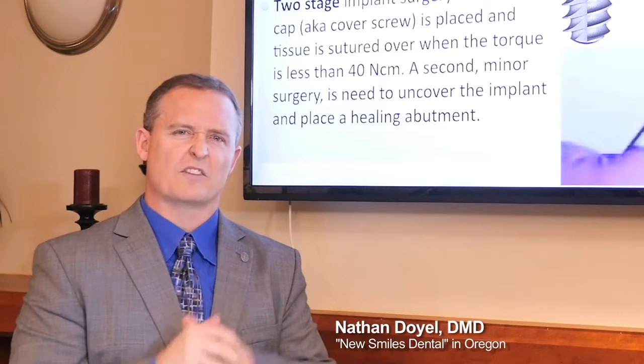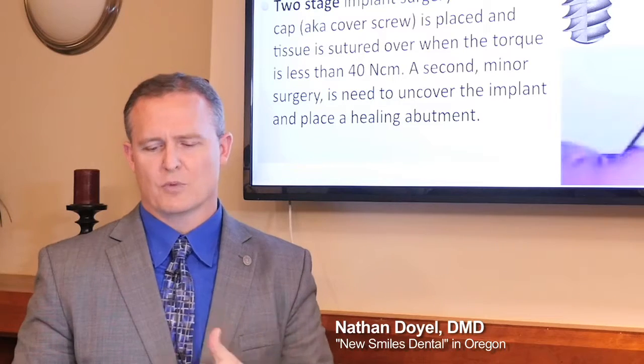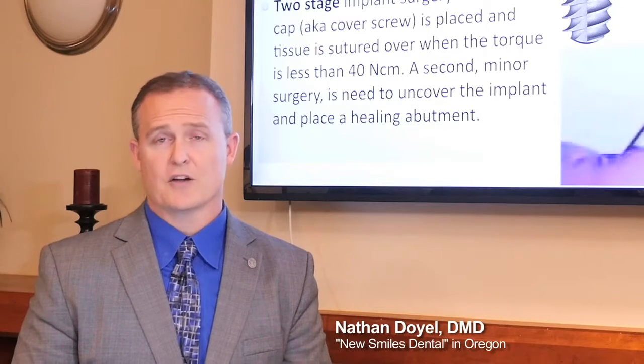But if it finalizes at 40, I want to know that too. So that's why I use a high torque wrench when I place my implants.